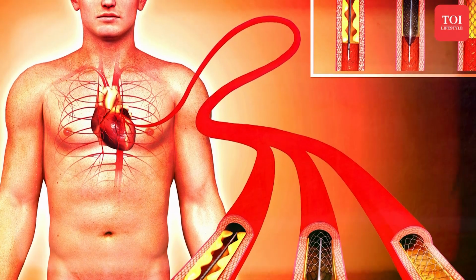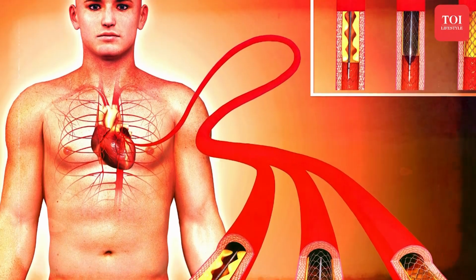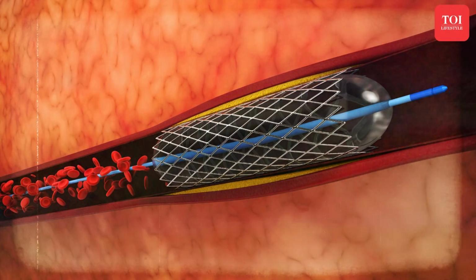Rota angioplasty is done with a standard technique to make it safe. We have published our own paper on doing a safe rotational atherectomy, and we do this for a lot of calcified blockages involving the main arteries as well.